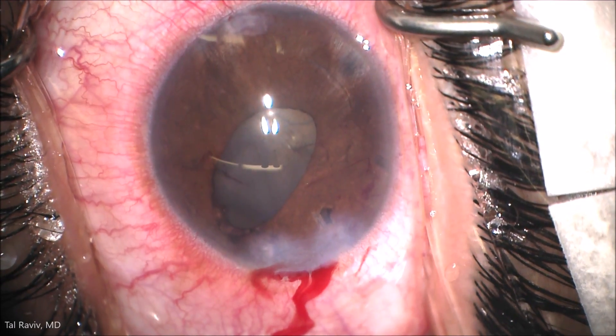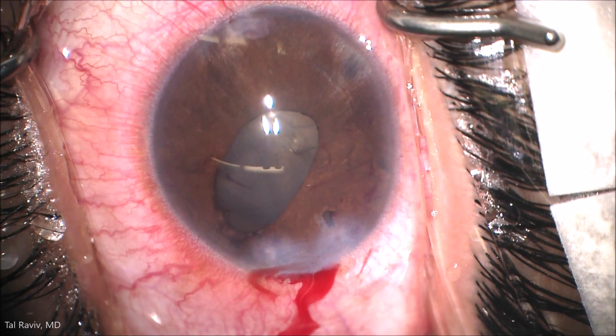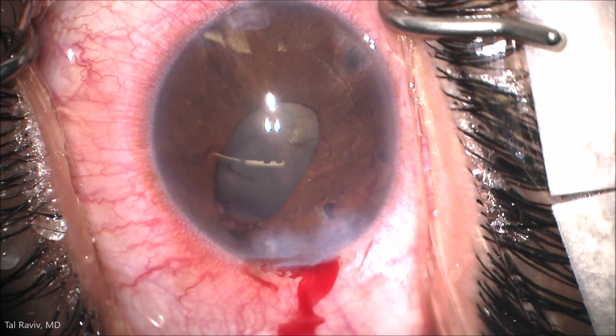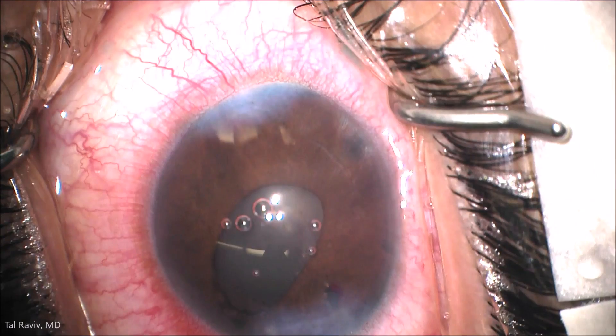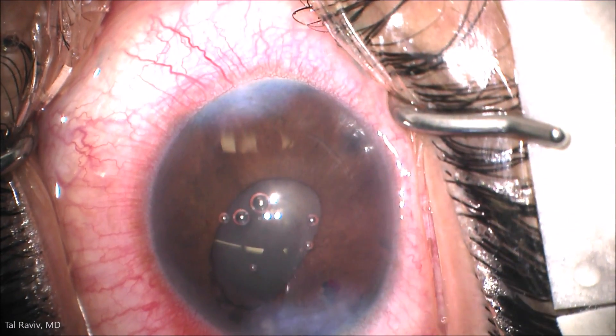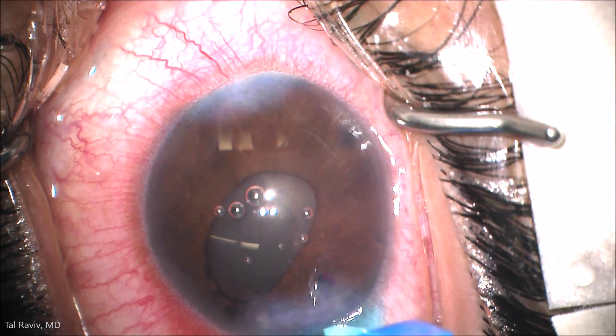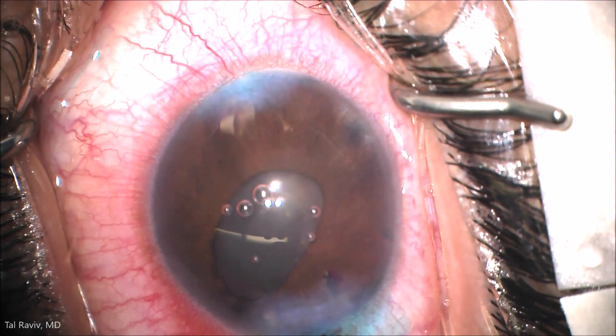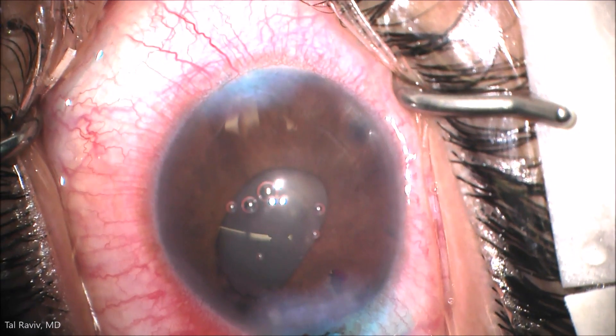Looking at the damage done, you can see the pupil ovalization and peripheral iris atrophy, as well as some early lens changes, all due to the implant. I've seen this in many, many cases. I finished the surgery by placing ReSure ocular sealant for a watertight seal on the eye.